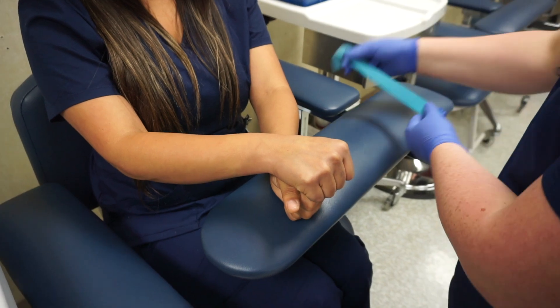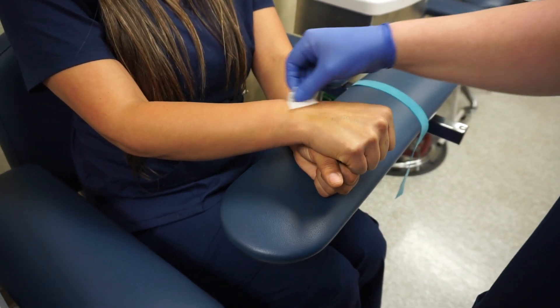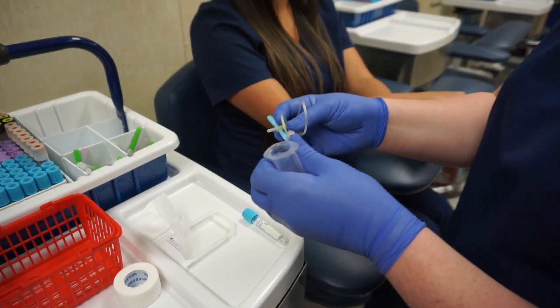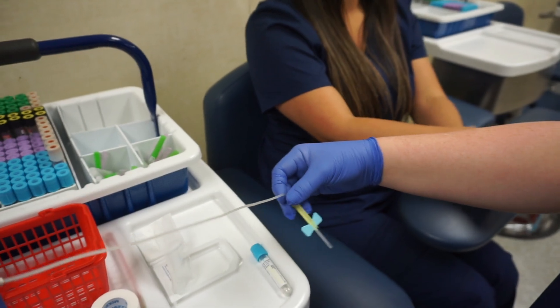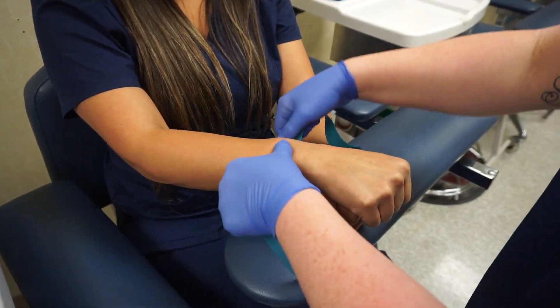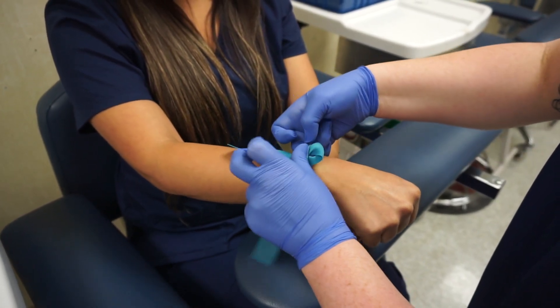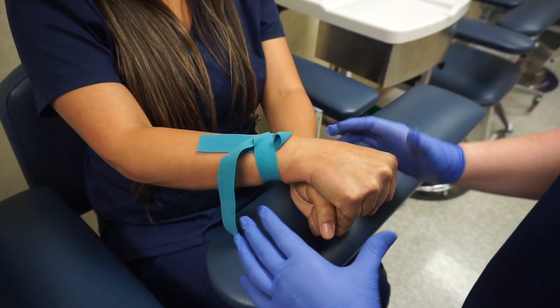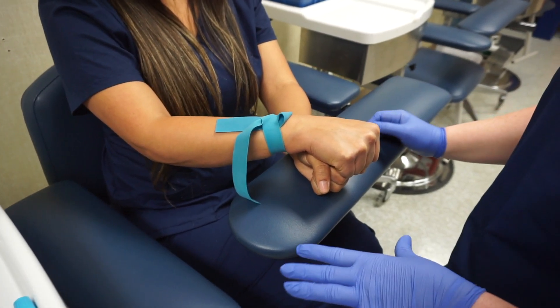Never go for what you see, because you can see veins in her hand clearly, but you always want to go for what you can feel over what you can see. So I found one here. I'm going to take the tourniquet off and come over to my station. Grab the alcohol and do concentric circles to clean where I'm going to go in. Then I'm going to take my wingset infusion. Always use the gray part to screw in. Be careful because these come apart sometimes. I have my tube ready as well. I'm going to come back and tie the tourniquet. Make sure not to touch the site after you have cleaned it — if you need to touch it again, you can always clean it again.